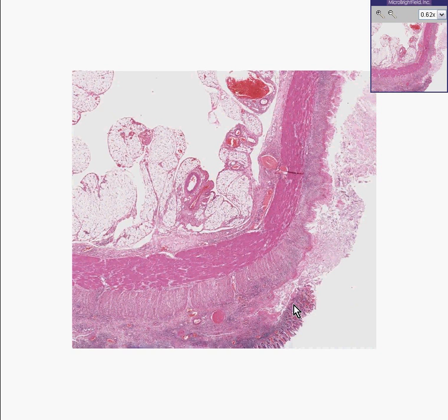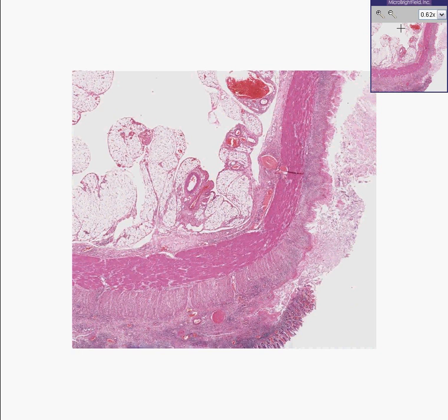Here is a mucosa, and here's a large ulcer as you could see, because there's complete absence not only of epithelium but of the entire mucosa.